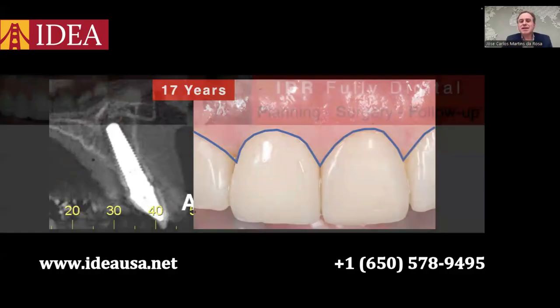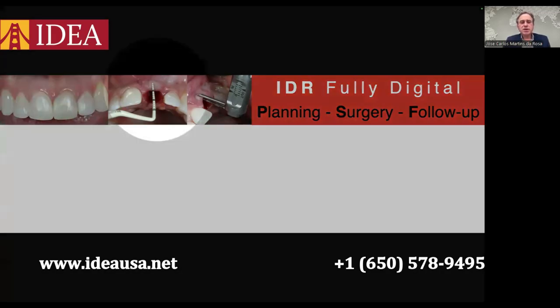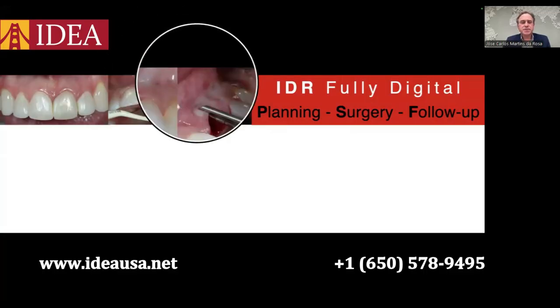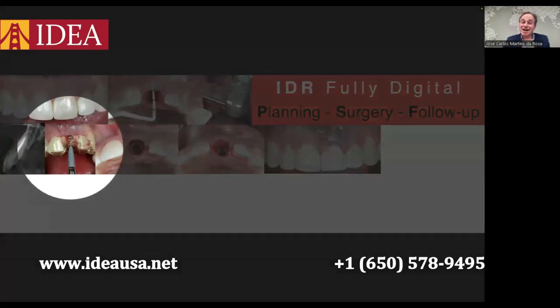But the IDR can be applied using a fully digital workflow from planning, surgery, and the follow-up. Look at this case. The upper left central incisor was condemned to be extracted due to a root fracture. Here we see just a confirmation that the buccal wall was gone. We evaluated the thickness of the soft tissue. You see here around 0.5 millimeters in thickness only. What we did here, we did the 3D digital planning. We installed the implant in the right position using guided surgery.